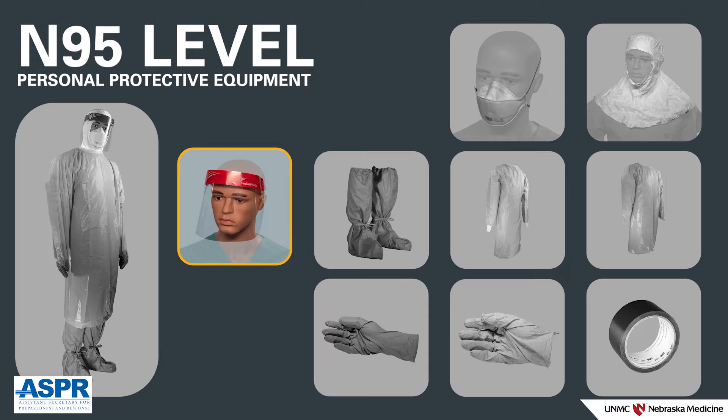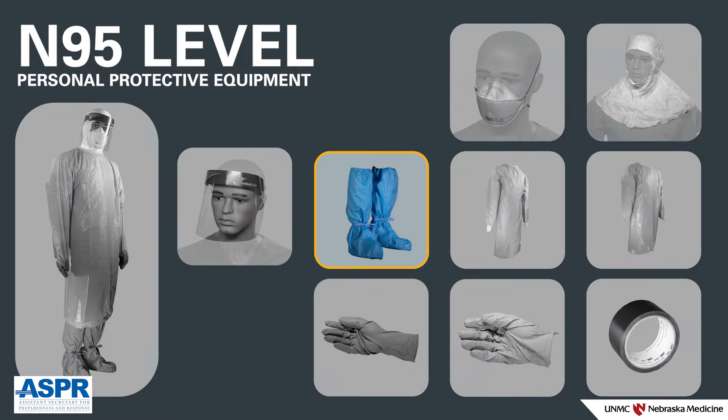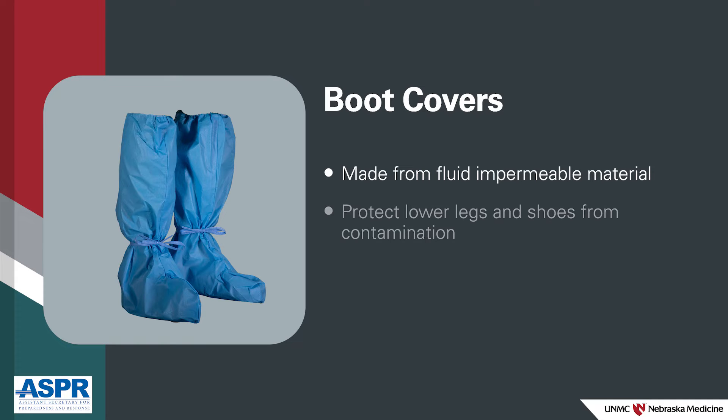Face shield — the face shield will protect your face and mucous membranes from splash or droplet particles. Disposable boot covers — the disposable boot covers are made from fluid-impermeable material and are worn to protect your lower legs and shoes from contamination.